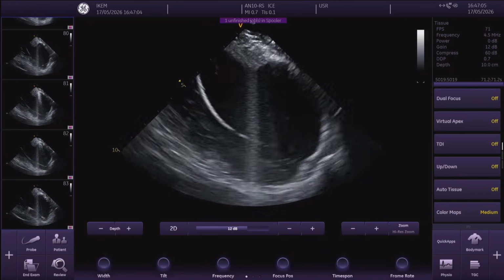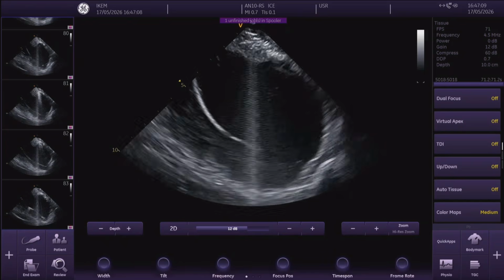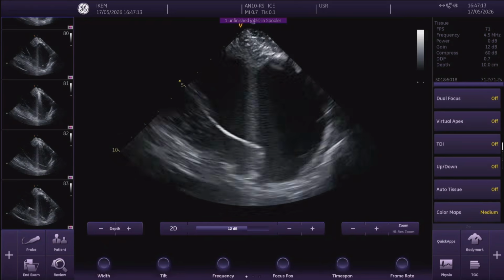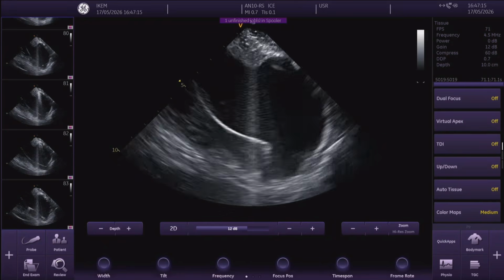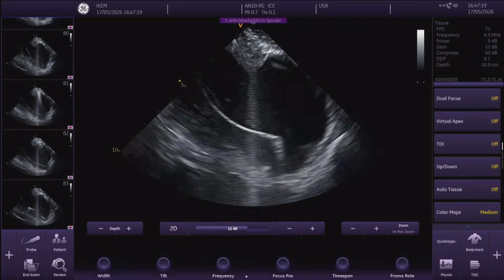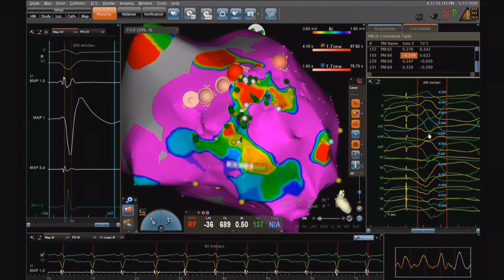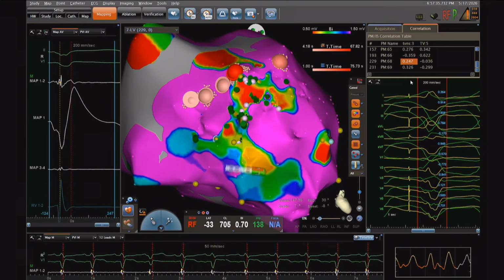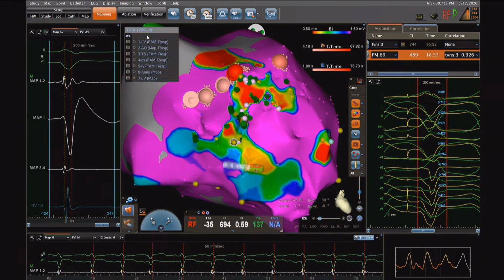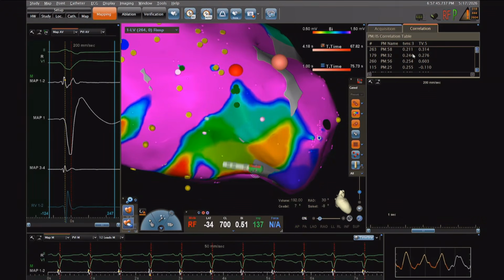There are late potentials, so we believe that we should isolate the core of this aneurysm, and that would be to prevent any future arrhythmias from this area, if we are already here. So this was quite a complex case, in which we believed that there would be a nice arrhythmia coming from the aneurysm, but it was not the case. But I think to show the principle of pace mapping as Christian developed, it was quite instructive.